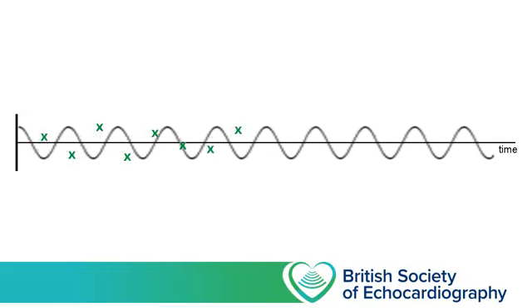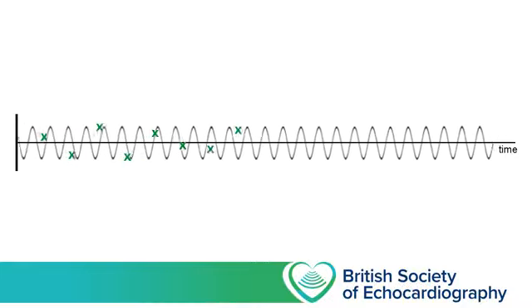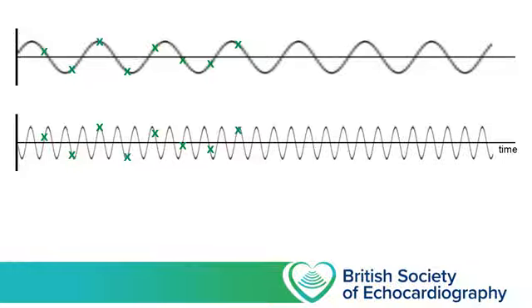It is however possible to find waves of a higher frequency that would be consistent with the samples that we've taken, and here's one such example. As you can see with this new wave, we've sampled it less than twice per period. So from our 8 sample points we're able to produce 2 regular sine waves with very different frequencies. If all the information we have to go on is those 8 sample points, then we don't know which of these waves is correct. But what we do know is that the sine wave that's currently visible at the top of your screen has the lowest possible frequency that could be correct, but waves with higher frequencies are plausible.